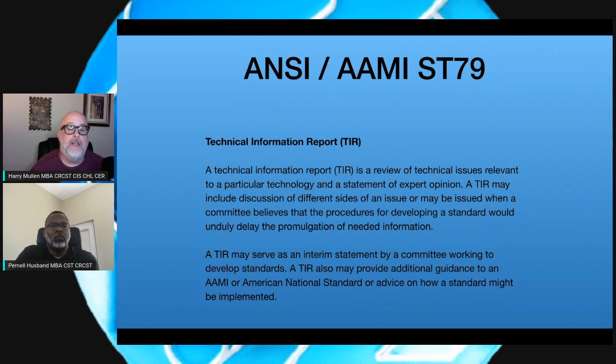Next, we have the TIR. And I always was like, well, TIR this, TIR that, what is a TIR? And come to find out, it's a technical information report. All right, so this report is a review of technical issues that are going to be relevant to a particular technology and a statement of expert opinion. So a TIR may include discussions of different sides of an issue or may be issued when a committee believes that the procedures for developing a standard would unduly delay the promulgation of needed information.